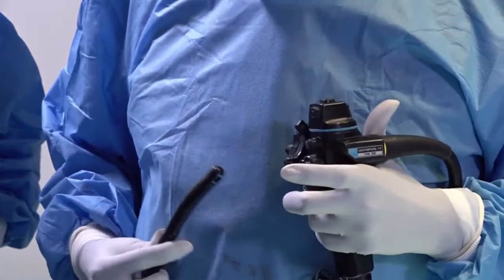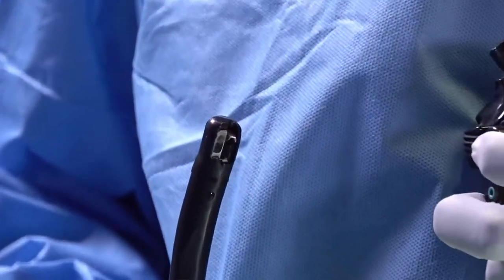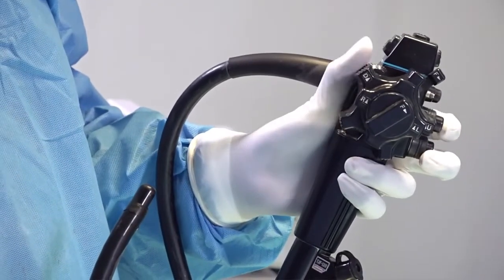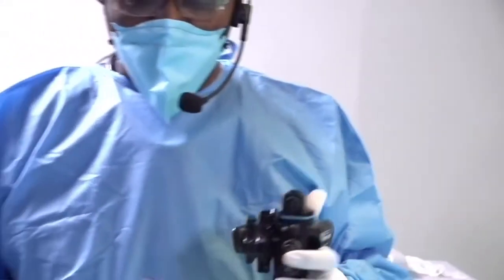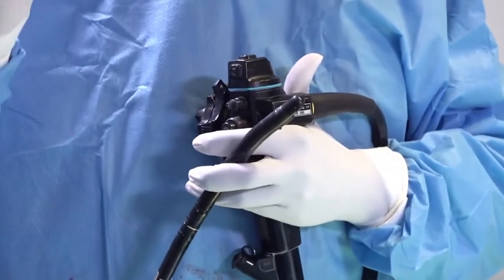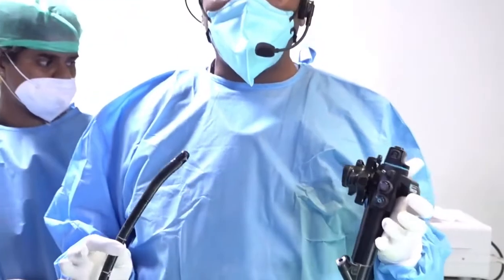So you can see absolutely the objective lens and the eyes are there. In addition, you can see something is moving up and down. That is what I call the elevator, controlled by your thumb. So in addition to the big wheel and small wheel, you have one more thing allocated for your thumb. That is the one difference. The second important thing is, of course, the channel is 4.2 millimeters, a fairly big one. So even a stent of 10 or 11 French can easily go in. So this is an ideal therapeutic scope.